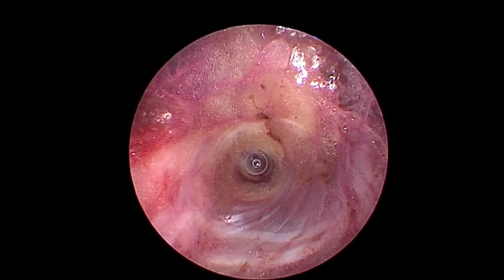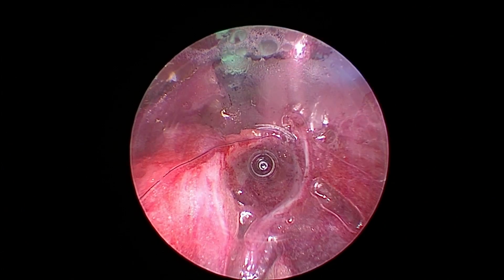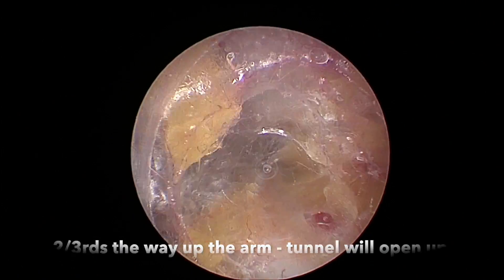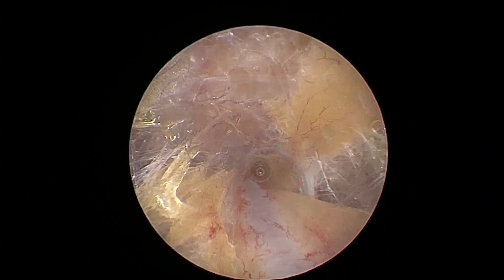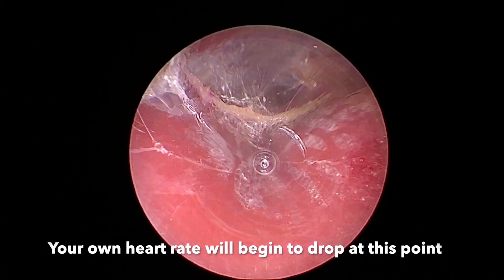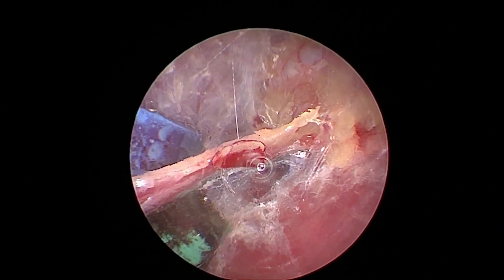You're always dissecting lateral to the veins — create a little window and sneak in there and take the branch. If you don't like the view you have, continue to do a little more dissection to open that window up. About two-thirds of the way up the arm the tunnel opens up, so you're actually able to get more anterior with the device and there's going to be much less resistance. Just stay disciplined — remain lateral to the veins and make your windows. At this point you start to breathe a little more easily because this is where the tunnel opens up and it's much easier to stay off the artery.